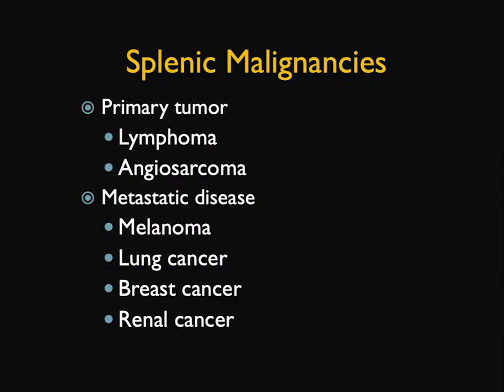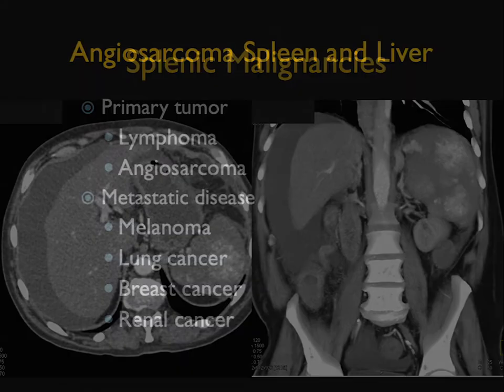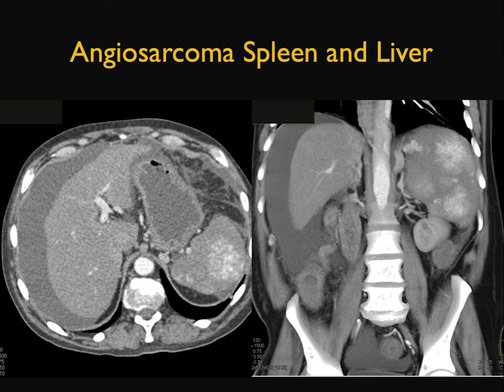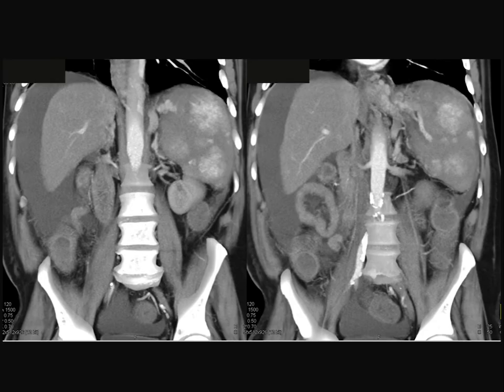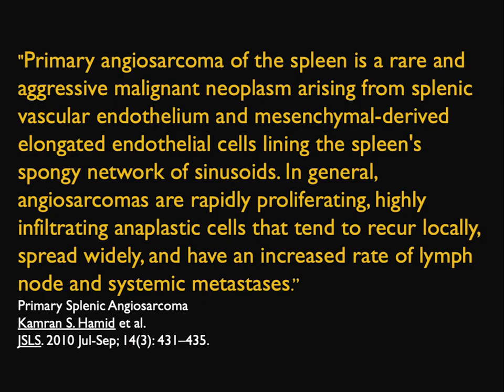What about malignancies? There are two main primaries: lymphoma is the most common, and then angiosarcoma, which is exceedingly rare — something we speak more about than see. And then of course, metastasis. Angiosarcomas are very vascular lesions with marked irregularity, ascites, and carcinomatosis. Angiosarcomas can spontaneously bleed, and you can see the extensive irregular enhancement. Angiosarcoma is a rare and aggressive malignancy — rapidly proliferating, highly infiltrative tumors that spread quickly.